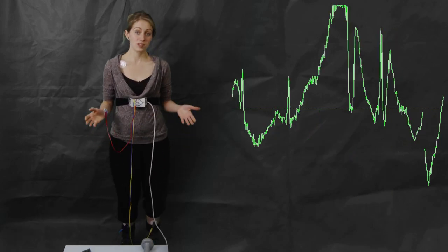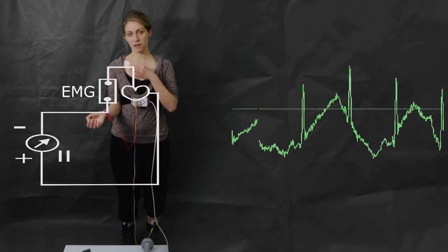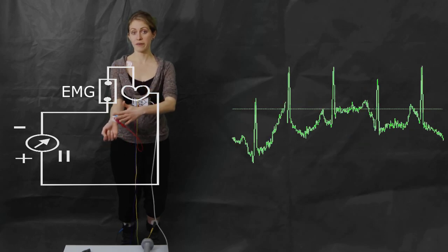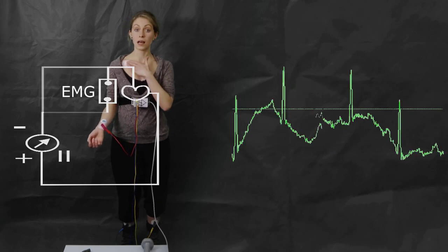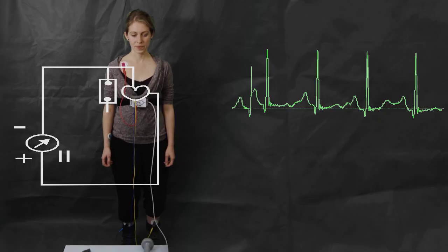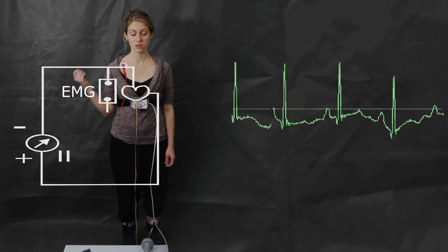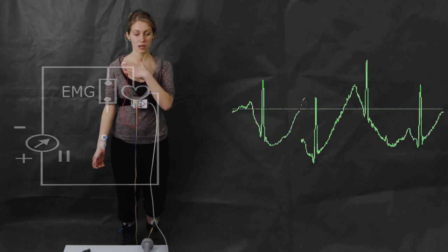Well, the simplest way to do this is to simply place an electrode a little bit higher, so not on my wrist, so that we avoid going into this area at all, and just place it higher, say here, closer to the collarbone, as I have done already. And let's see if I connect the negative input here in this electrode. Let's see what signal we get now. So if I start doing any movement here, it doesn't really affect the recording at all because there's no connection down in this area. It all comes down here.